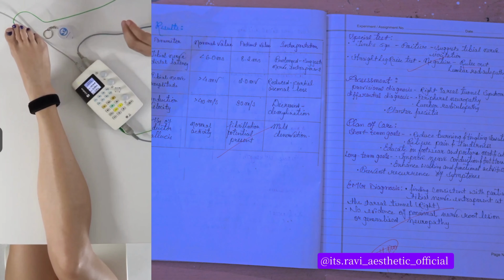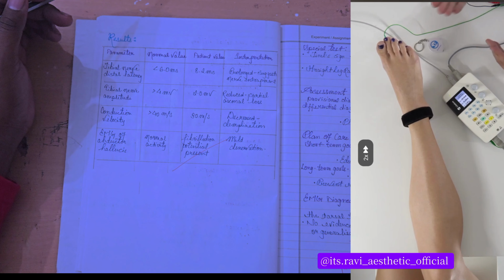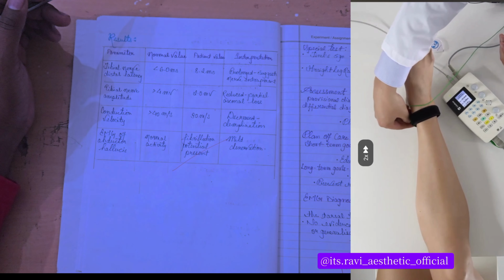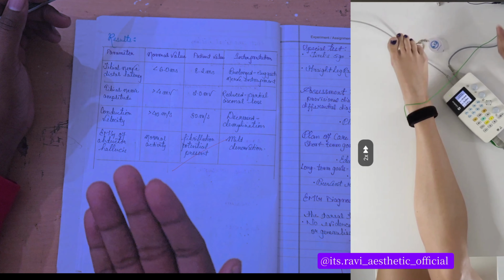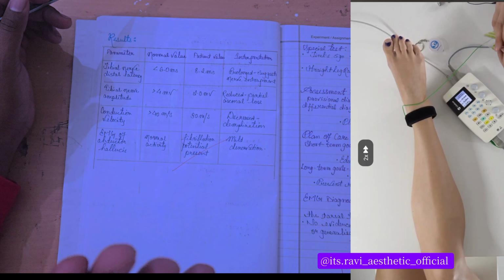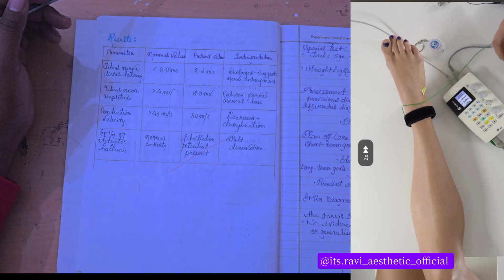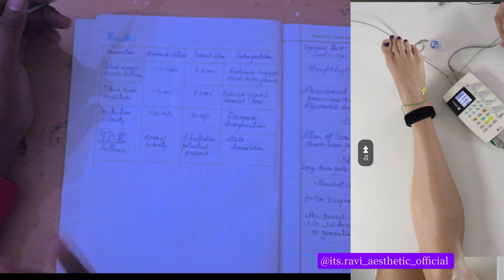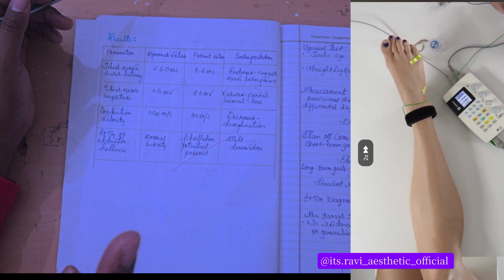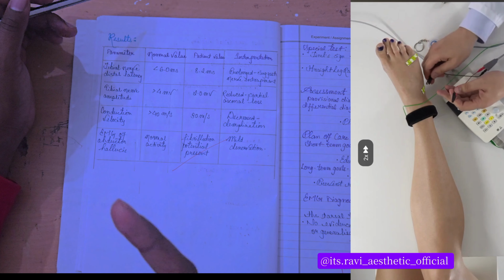So what I can show is the EMG machine for the nerve. The EMG machine has two types of electrode, surface electrode or needle electrode. We use a needle electrode so that for each and every muscle we can see whether it is innervated or denervated, which muscle is having pain, twitching, cramping, or nerve irritation. So for each specific nerve we can use the needle electrode or a single wire electrode. So what is the result?